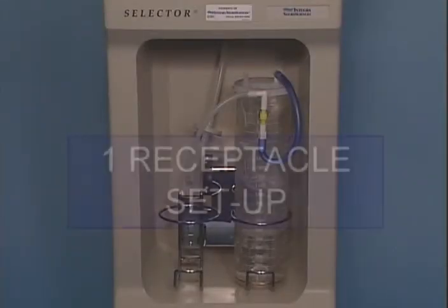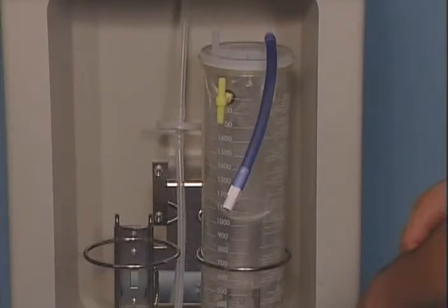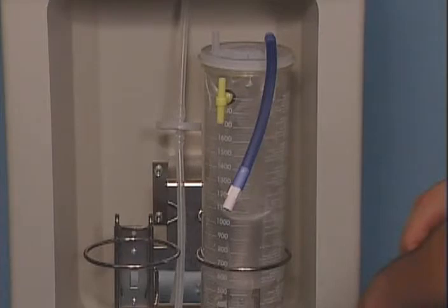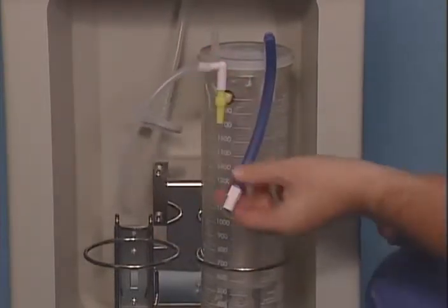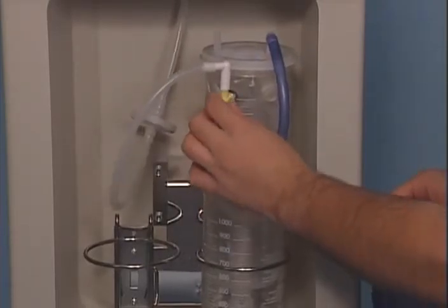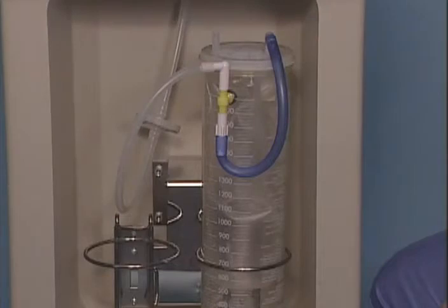When surgery demands the use of 1 receptacle canister, the following directions are recommended. Step 1. Place the filtered Abbott liner with blue tubing into receptacle to the right. Make sure that the liner is well sealed to the canister. Step 2. Take the vacuum port tubing and connect to the top of the yellow T. Step 3. Take the blue tubing and connect the end to the bottom of the yellow T. At the end of this setup, you will notice that the top of the canister has a patient port open. This is where the tubing from the handpiece will be connected.